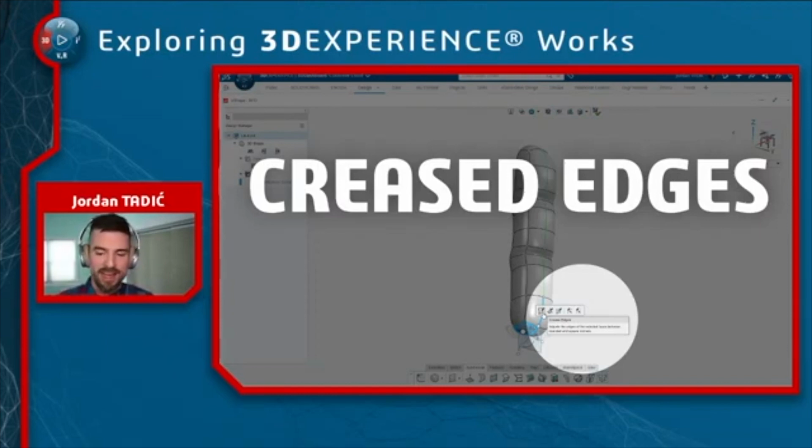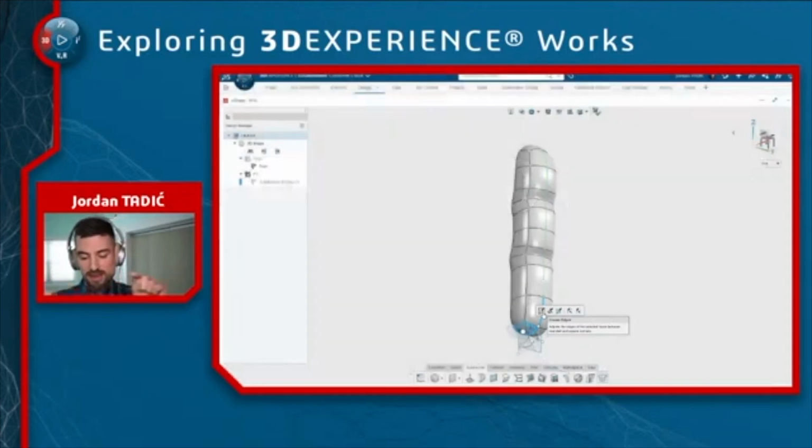But before I do that, I want the bottom of the finger to be perfectly flat, just so that I can have a flat surface for integrating with the rest of the design. So I'm going to select crease edges. And with the crease edges, you don't have to select just the edges to crease. You can select a face, and that's like a shortcut for selecting the 4 faces that surround that. Or in this case, because we have symmetry on, it's like selecting the 6 faces that surround that entire loop and creasing them all at once.